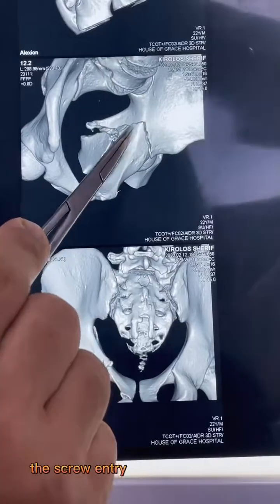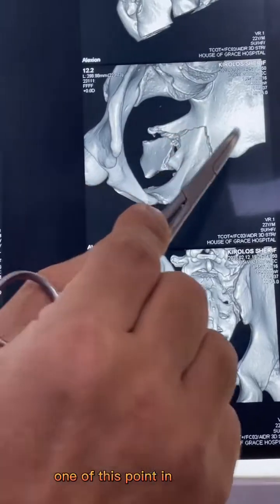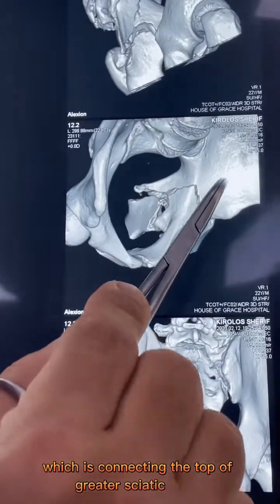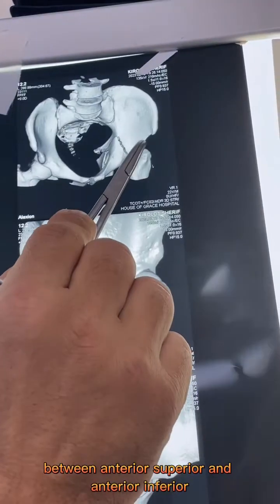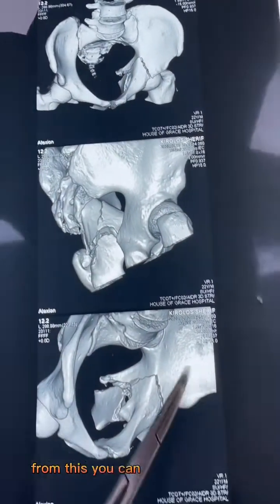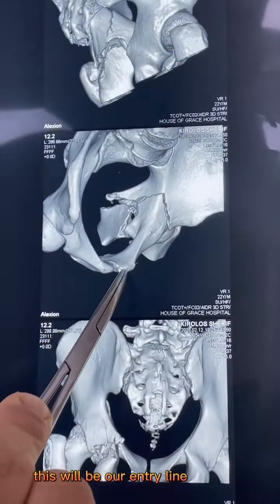So the screw entry point will be along this line, one of the points in this line, which is connecting the top of the greater sciatic notch to the interspinous part of the ilium between the anterior superior and anterior inferior. So this is the line. So from this you can appreciate an even closer view. This will be our entry line.